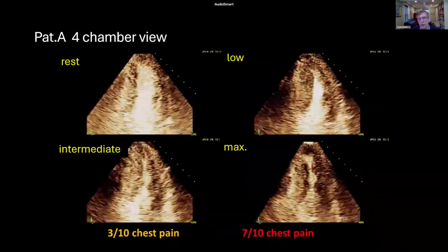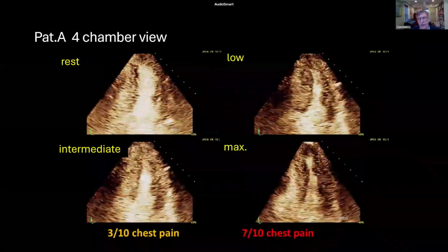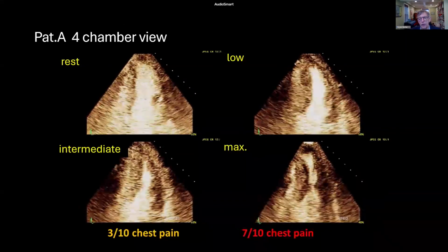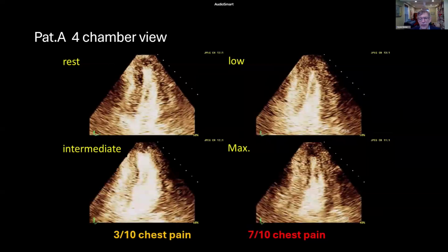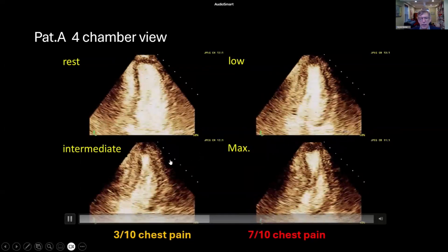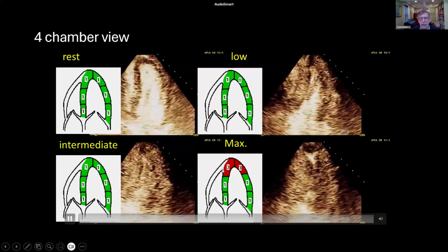Again, the first thing that comes to mind is that the apical shape in systole looks different. We don't clearly see the break point, but there is one thing I want to remind you: when you acquire loops during stress echocardiography, always record at least 2. We usually record 4 loops for each stage and for each view. When you take another view, a little bit later, you can see this abnormal shape here, which is not triangular as it is here. We can now also appreciate a breakpoint, and here you see how we report it: we report the 2 apical segments as akinetic.